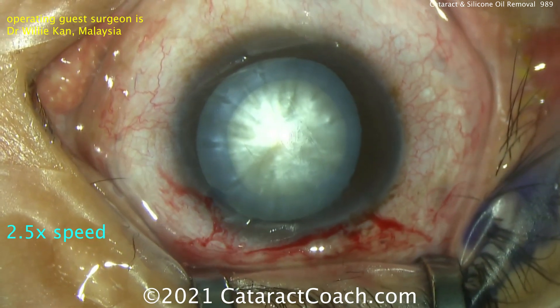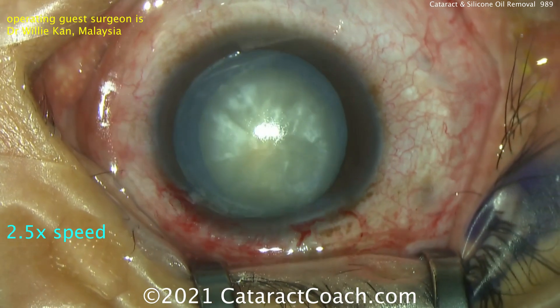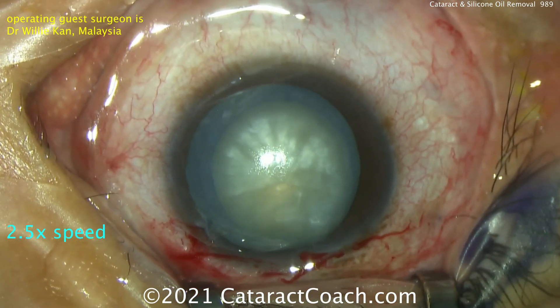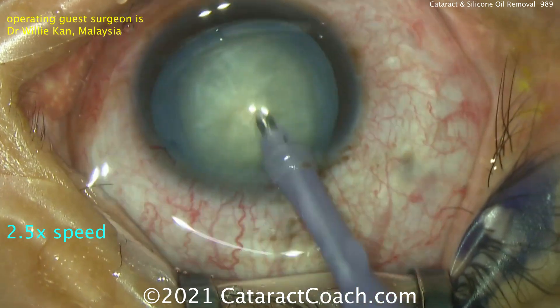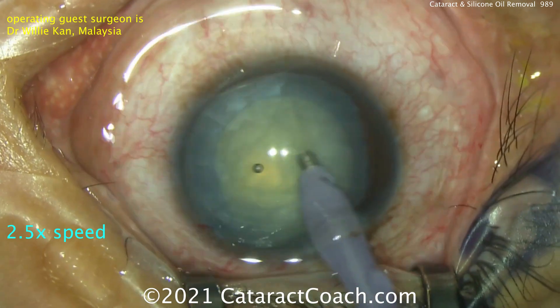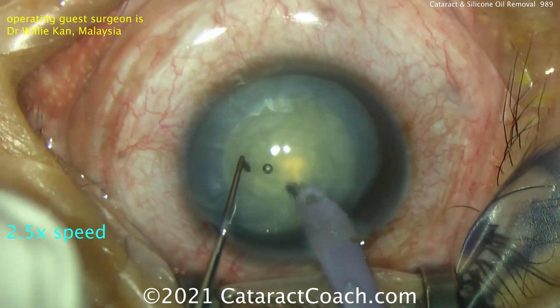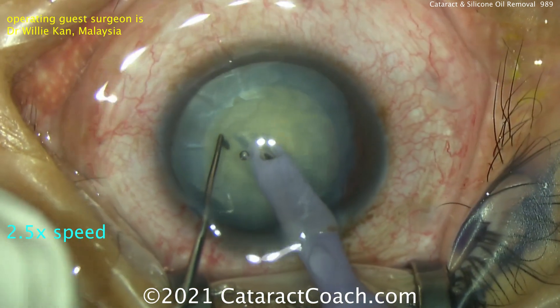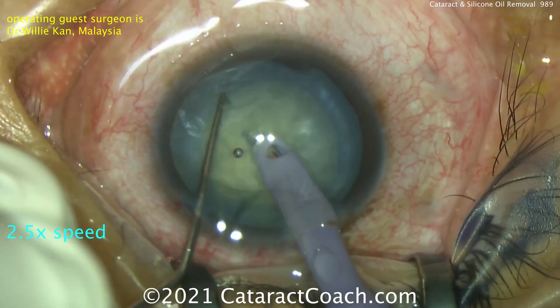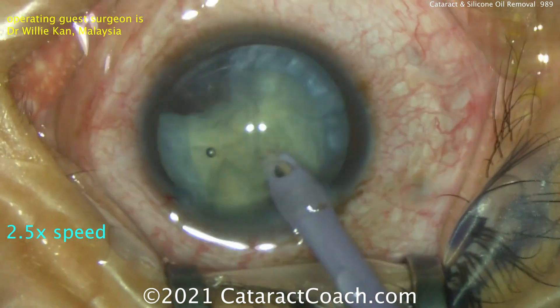We've sped up the video so we can get to the good stuff and show you all the important parts of the surgery. Gentle hydrodissection being done. There's the nucleus — a nice capsularhexis there, about a five millimeter rhexis. This nucleus will be removed. When doing the cataract part like this, the surgery is pretty routine. We're sure this patient did not have any damage to the posterior capsule during the vitrectomy, so there's no worry there. This nucleus is well supported — even in a post-vitrectomy eye, it's easily chopped and well supported by all the silicon oil in the vitreous cavity.